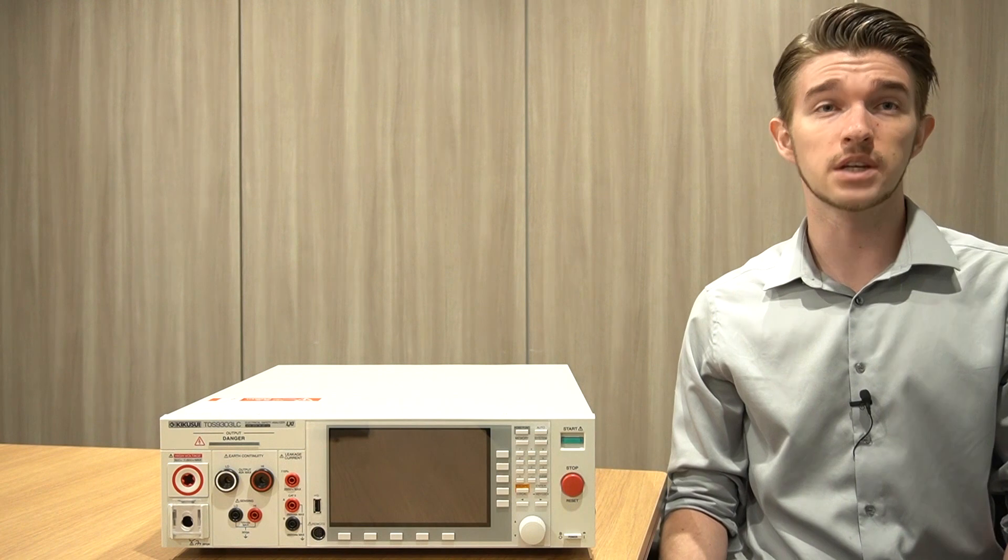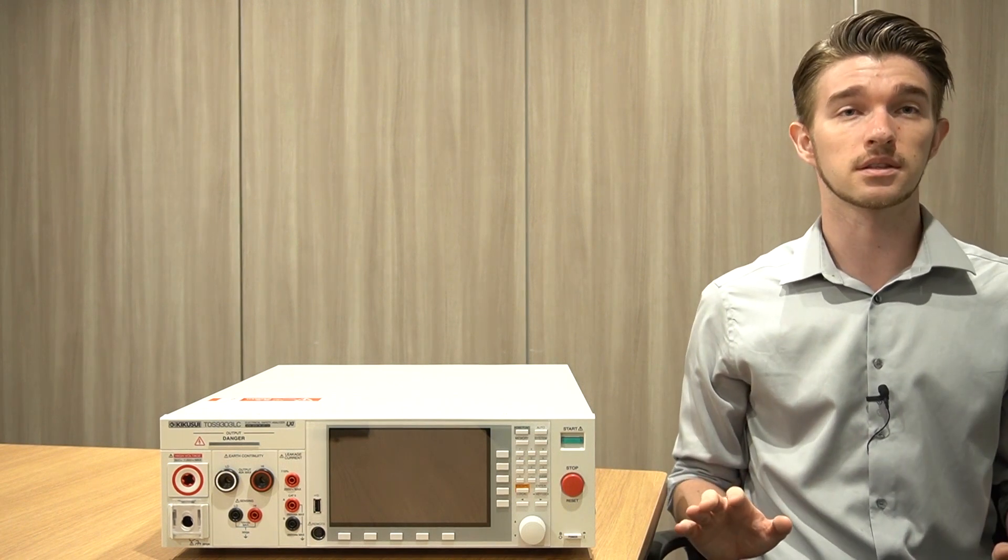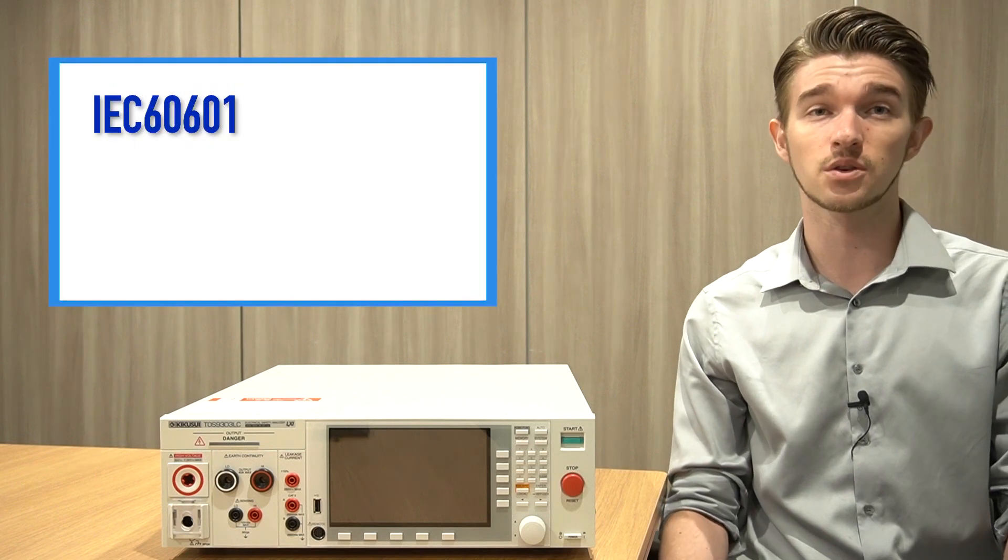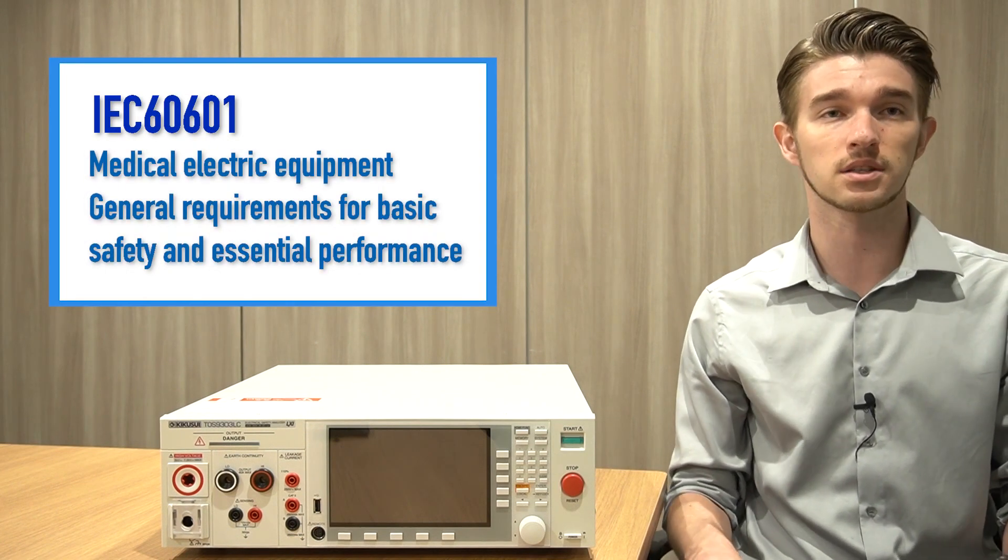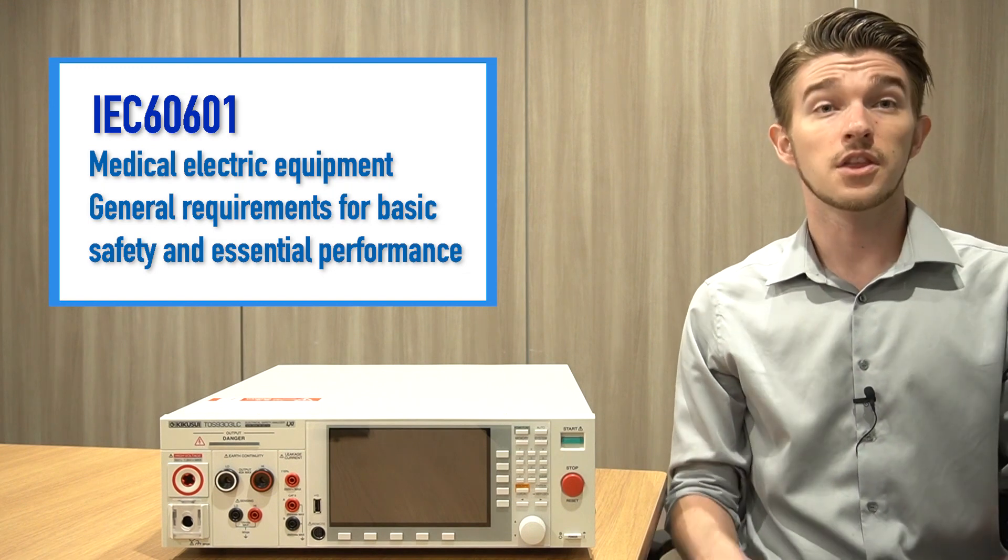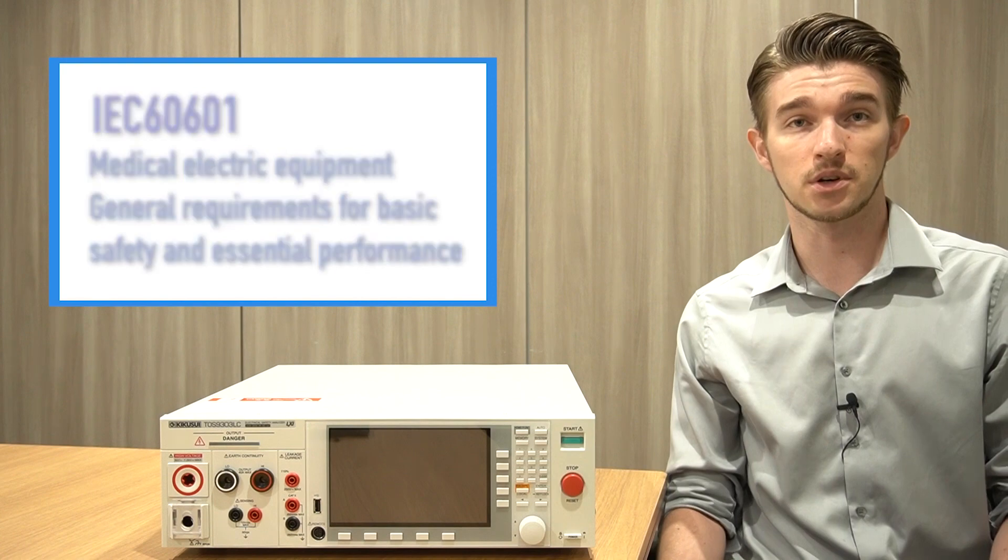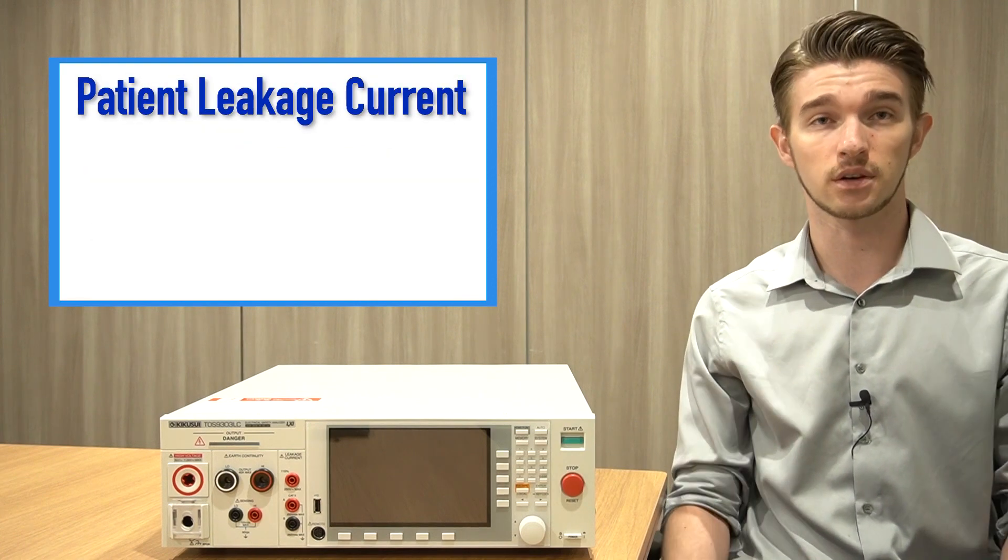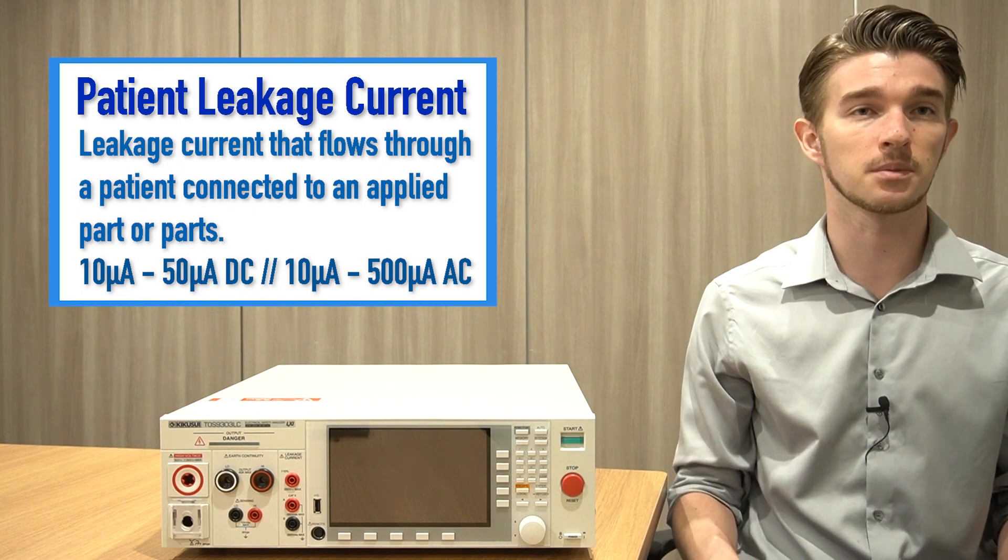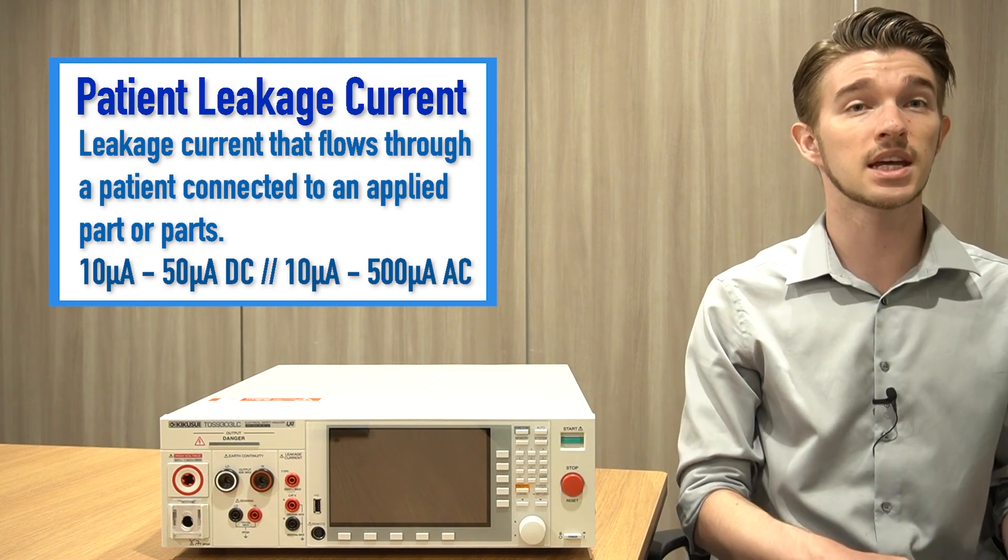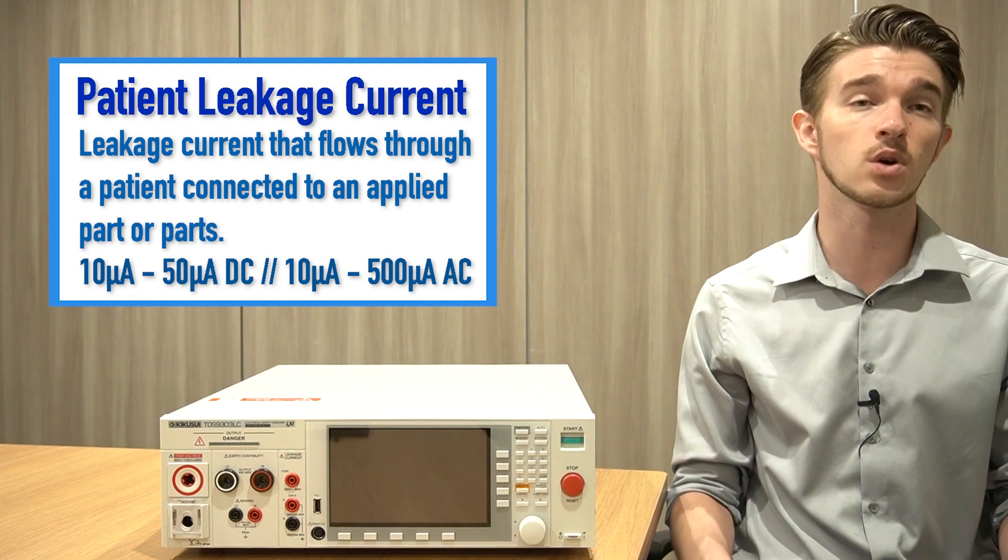In order to protect patients from even the smallest traces of leakage current, standards for medical devices such as IEC 60601 define strict requirements for protection against electric shock hazards. These standards include electromedical device-specific safety parameters such as patient leakage current, which can range from 10 microamps to 50 microamps DC, or 10 microamps to 500 microamps AC, depending on the equipment classification.